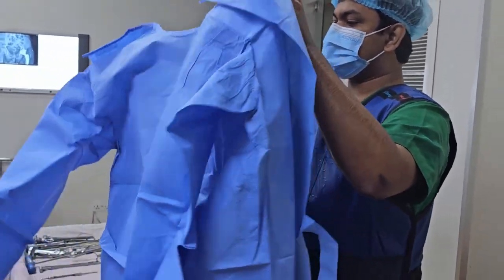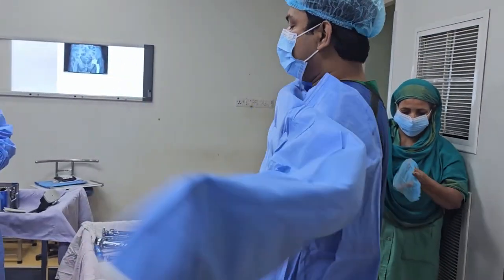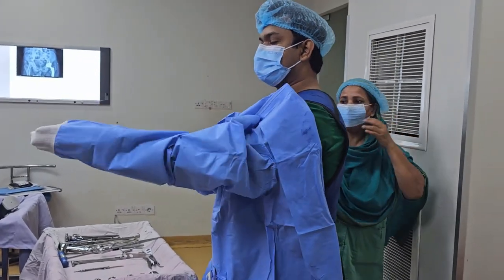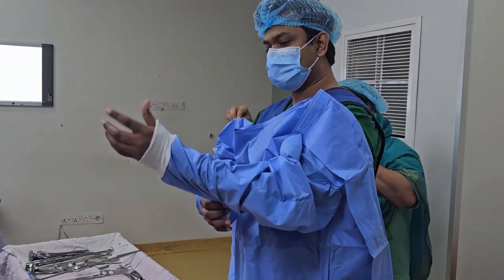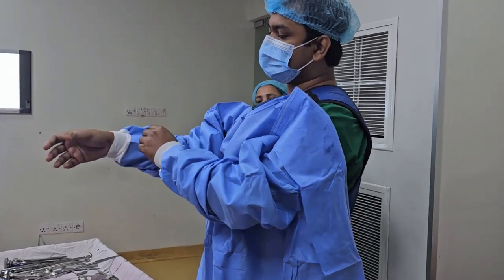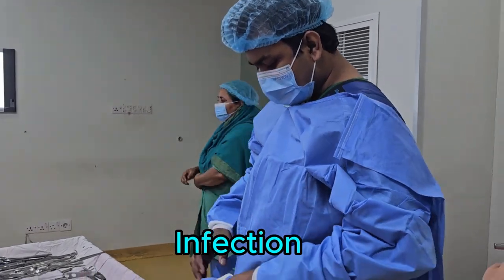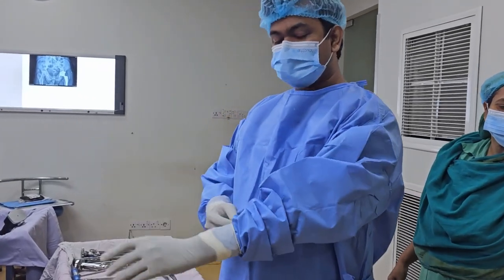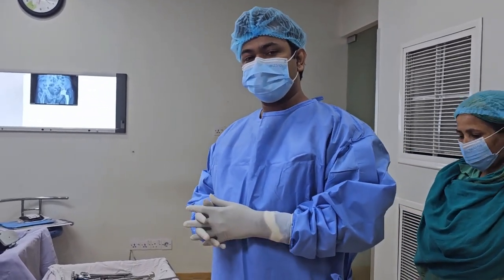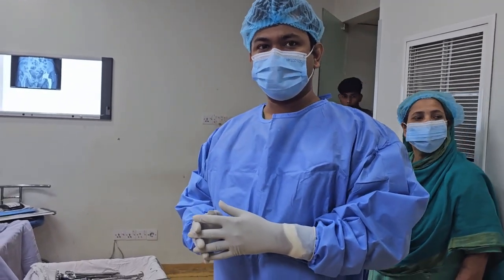This is a disposable gown — completely sterile — which is used in total hip replacement surgery. The most dreadful complication of total hip replacement, or any kind of joint replacement surgery, is infection.